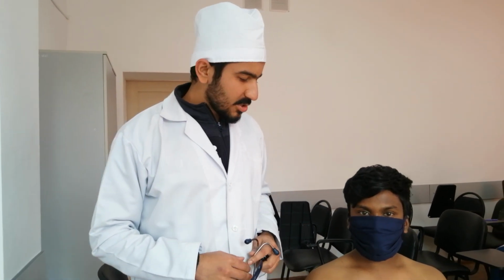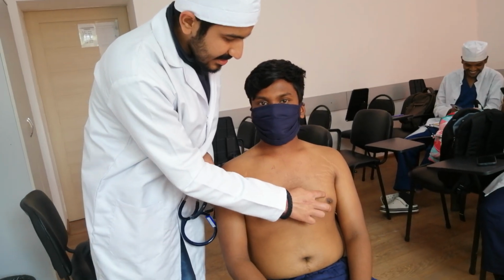My name is Mohit. I am of OMA 223 and today we are going to see the auscultation of the heart. First we are going to check out the mitral valve point, which is located in the fifth intercostal space, mid-clavicular line, left side here.